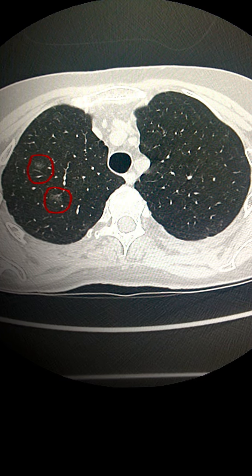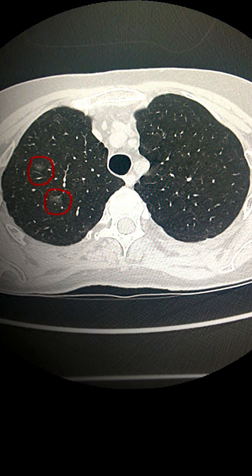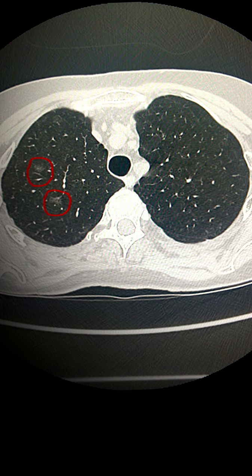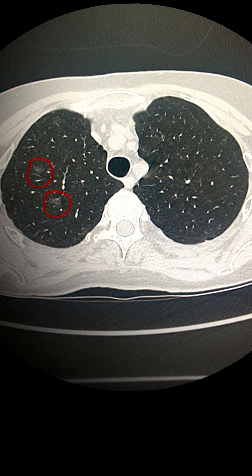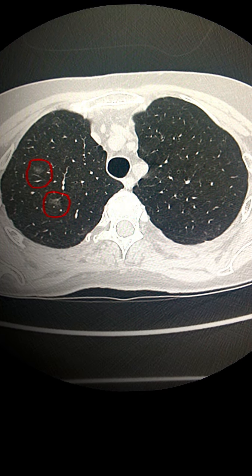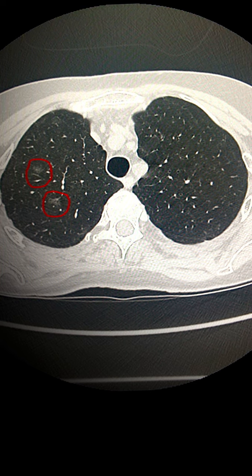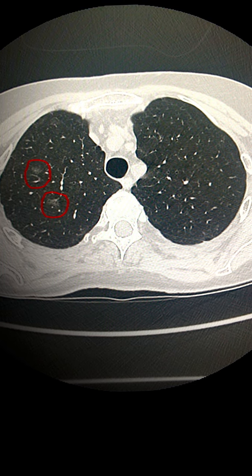In this video we will be looking at how to evaluate a ground glass density nodule. This is commonly encountered in radiology practice and as you can see on this CT image there are two such nodules highlighted.